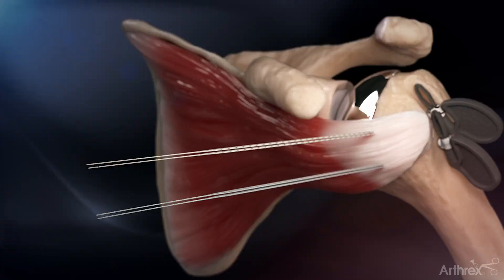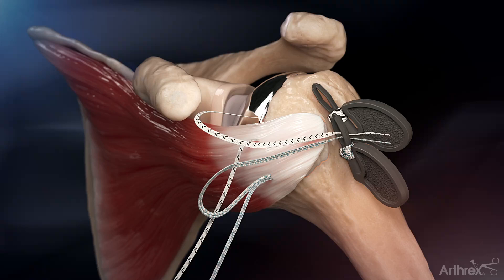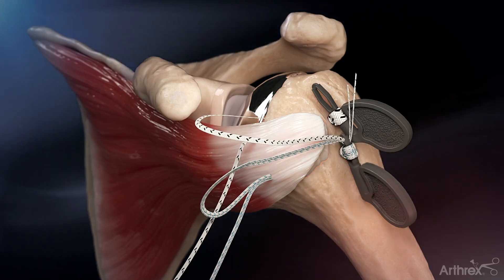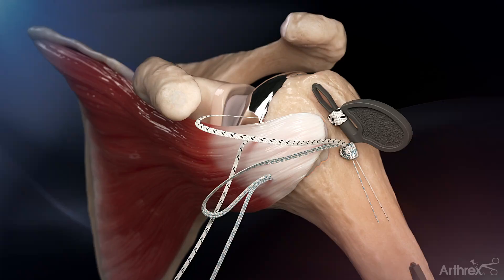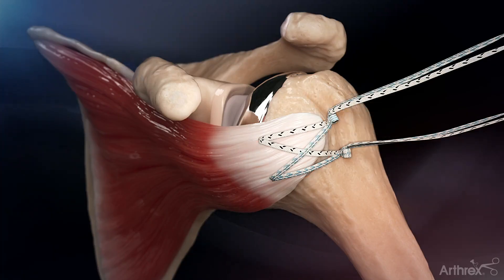The tapered end of each suture type — fiber tape and tiger tape — are passed through the suture passer eyelet. The suture loader is pulled, which passes the tapered ends through the preformed knot. This process is repeated with the remaining suture limbs.